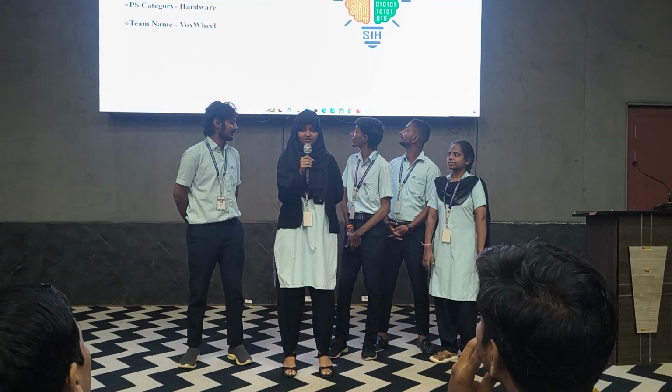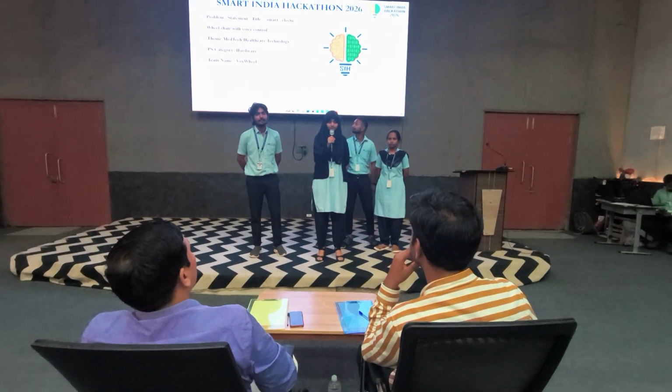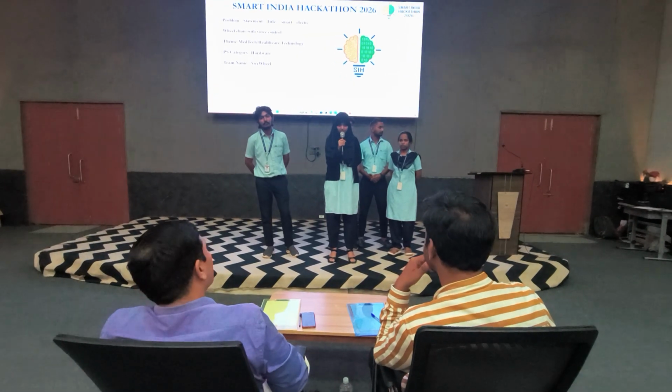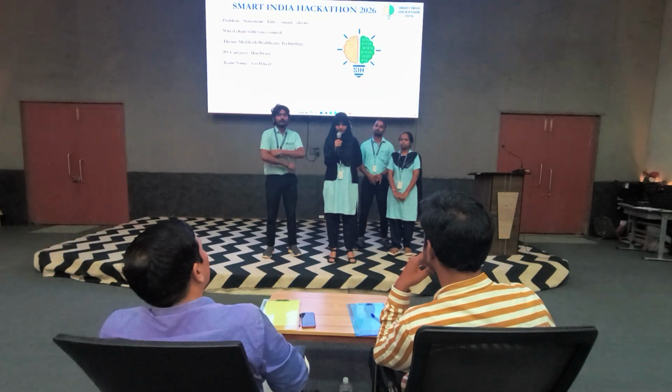Good afternoon, everyone. Our topic is on smart wheelchair with voice control. Basically, we have built this for patients or any disabled people, paralyzed people, or anyone of old age, people who are not able to move freely.